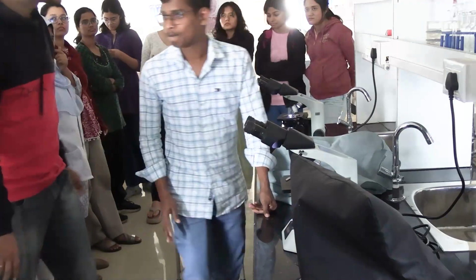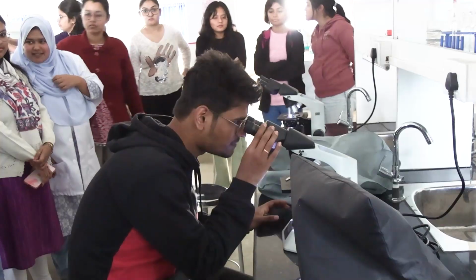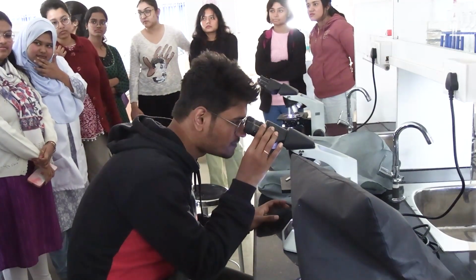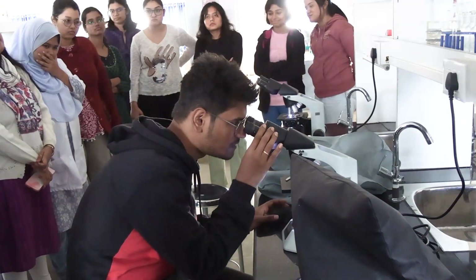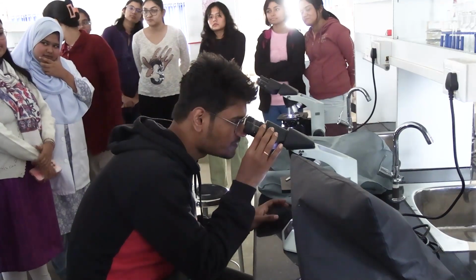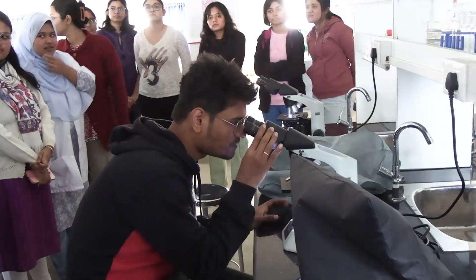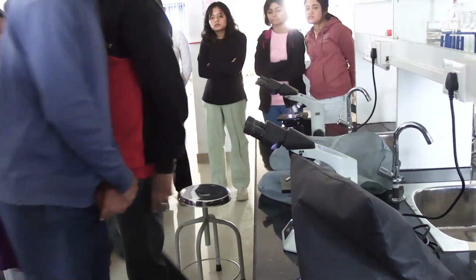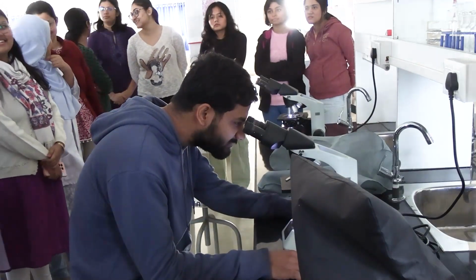তুমি দেখেছো কি লেগেছে তোমার? নর্মাল লেগেছে, ঠিক আছে। তোমার কি মনে হচ্ছে? মাইক্রোসাইটিক, আচ্ছা। ক্রোমাশিয়া ব্যাপারে নর্মাল, আচ্ছা, মানে মাইক্রোসাইটিক নর্মোক্রমিক এটা বলতে চাইছো। কি মনে হলো তোমার? মাইক্রোসাইটিক নর্মোক্রমিক নিজে থেকে বলছো নাকি ওদেরকে শুনে বলছো?